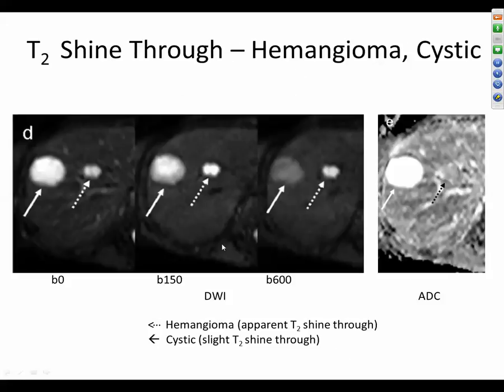Well, I'm sorry, you said the operator, the MR tech can choose the B value, right? Yes. That has to do with the gradient and the big delta and the small delta. So when they give us these in a sequence, when it goes from B0 to B150, does that mean that the gradient was decreased? There was less gradient applied on that sequence? No, B0 means no gradient. Okay. And so B150 means there was some gradient. Yeah, the B factor is set to be this small number, so there will be some gradient. And here they use a larger B, that means the gradient is stronger or longer, or long time to dephase. So the signal will decay, but contrast will increase.